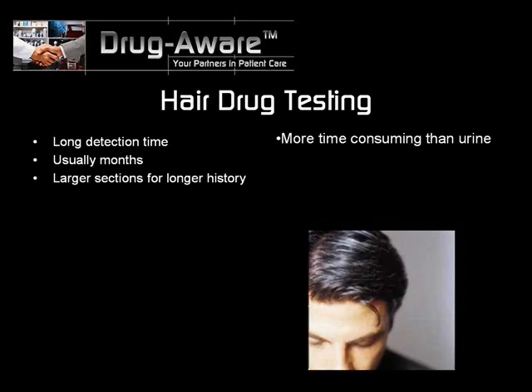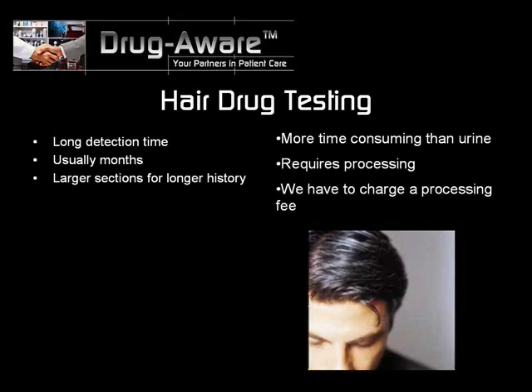The process is more time-consuming than urine testing, as the hair needs to be processed before it can be tested. We consequently have to charge a processing fee, followed by a charge per drug, per section. Hair testing normally takes around a week to complete, although we ask customers to allow up to 10 working days if workloads are high.